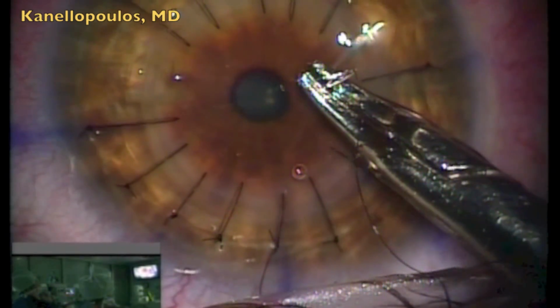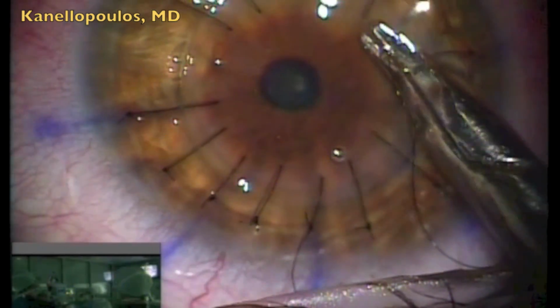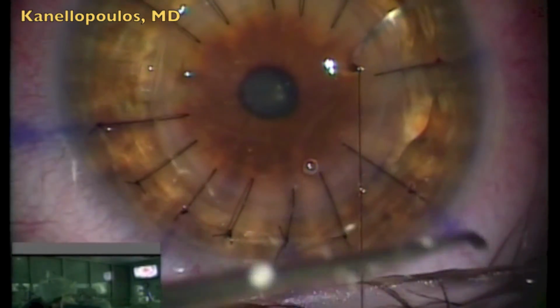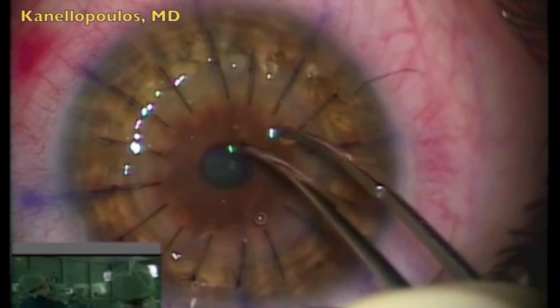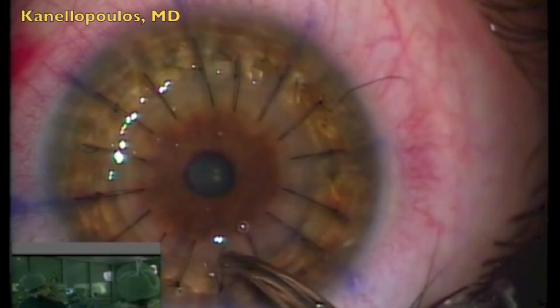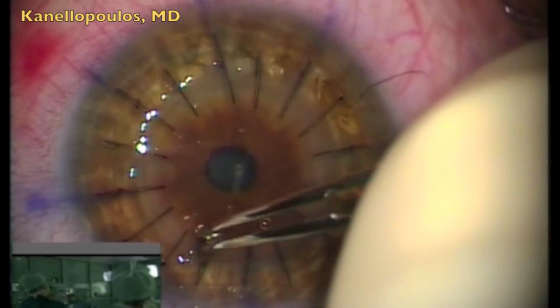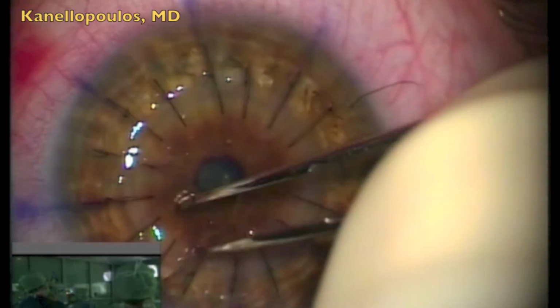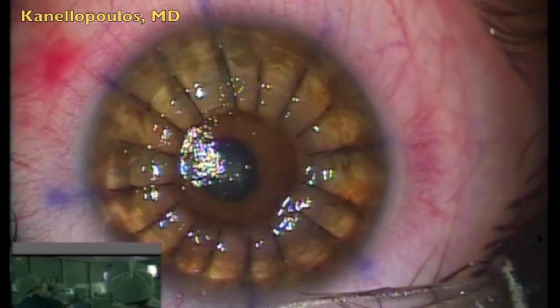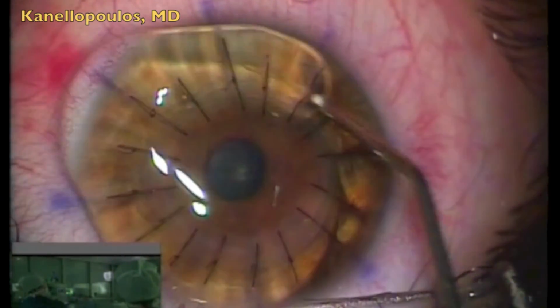With the mushroom approach, which I found favorable for keratoconic eyes, we're transplanting large corneal surface with the least endothelial layer. You can use 8 interrupted with 16 running in my practice, or the 16 interrupted here, but the graft can probably hold with just 8 interrupted sutures.